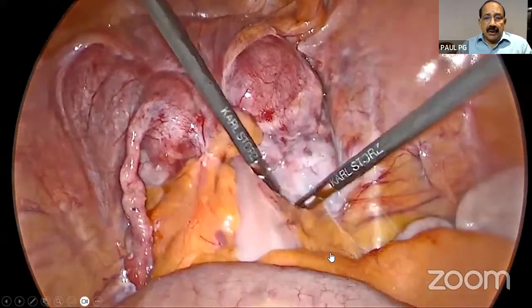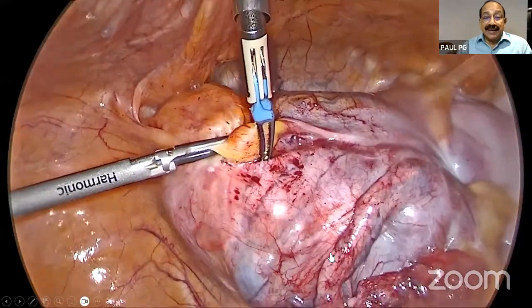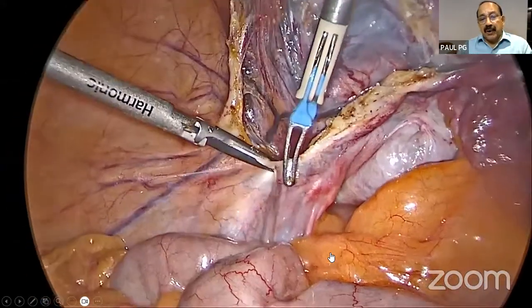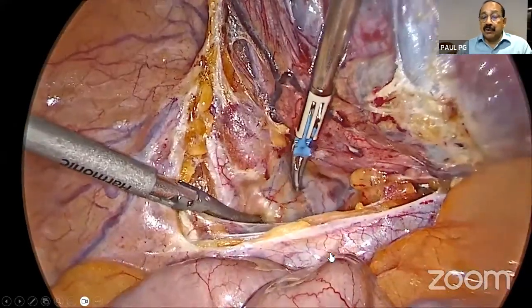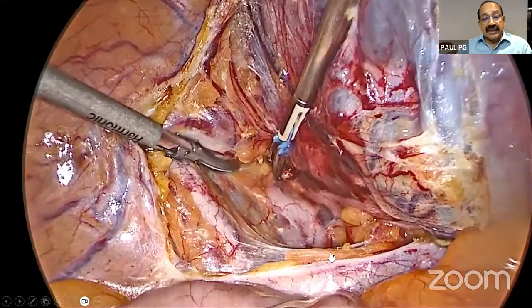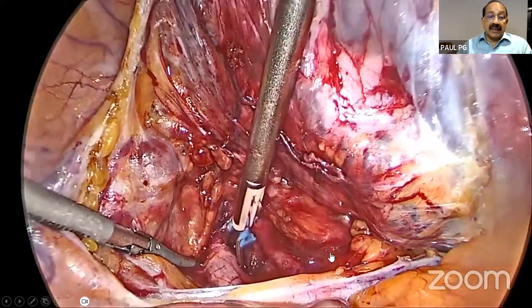Ureterolysis: now we find our youngsters are more experienced than us because we all started late. They all started at the beginning itself. It's comparatively straightforward. In the majority of cases, you can open this lateral triangle or go medial to the infundibulopelvic ligament, and you can identify the external iliac vessels, the ureter, and where the uterines arch over the ureter.